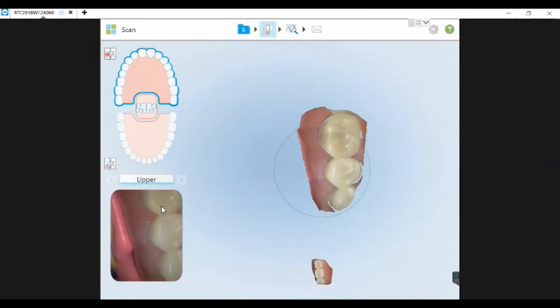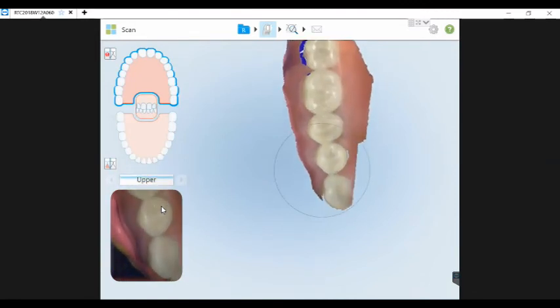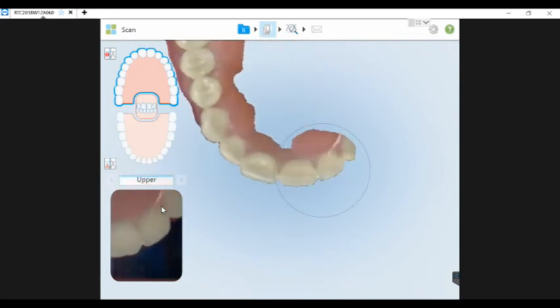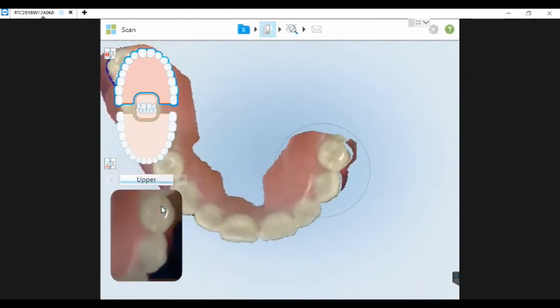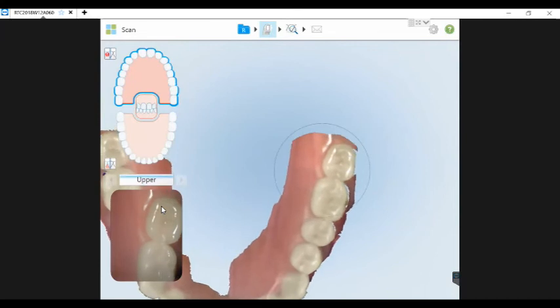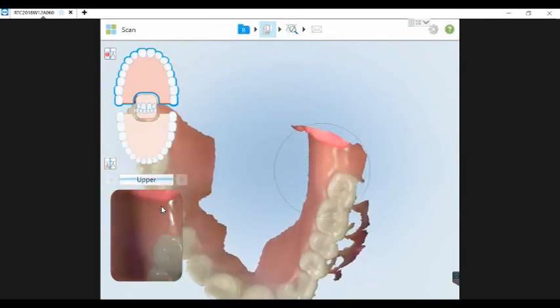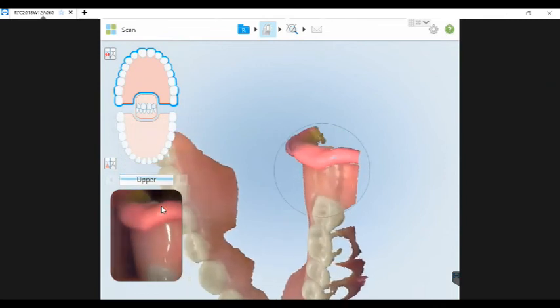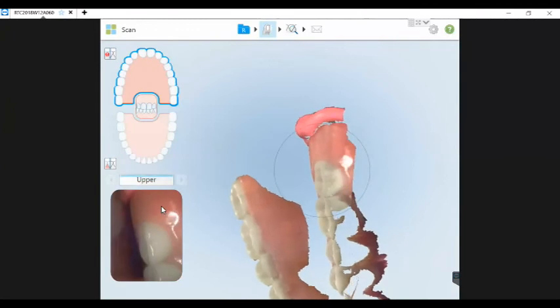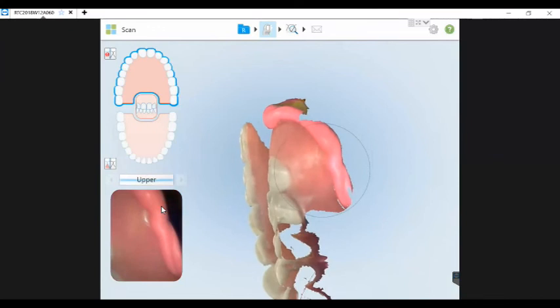Okay, so I'm doing the occlusal surfaces. Remembering that we do not necessarily need the tongue side of the palate. Now I'm going to go ahead and rotate to the buccal. And this already has that wash impression in it. And I'm going to finish with the intaglio.